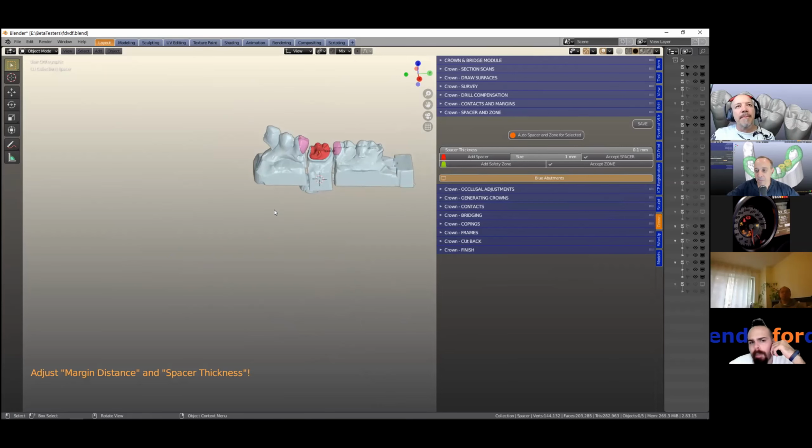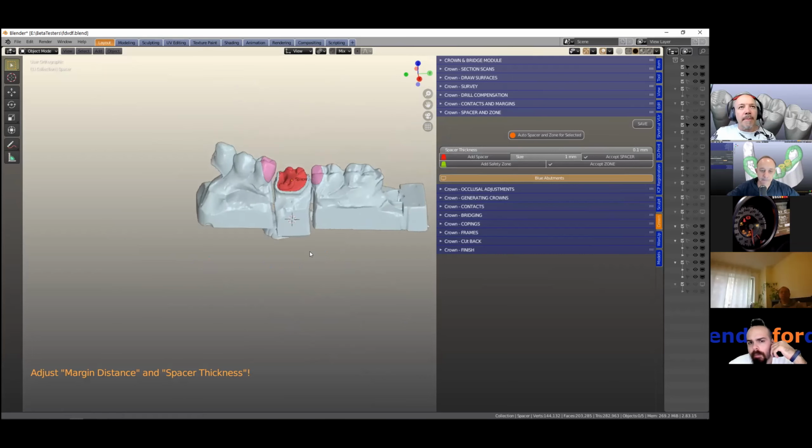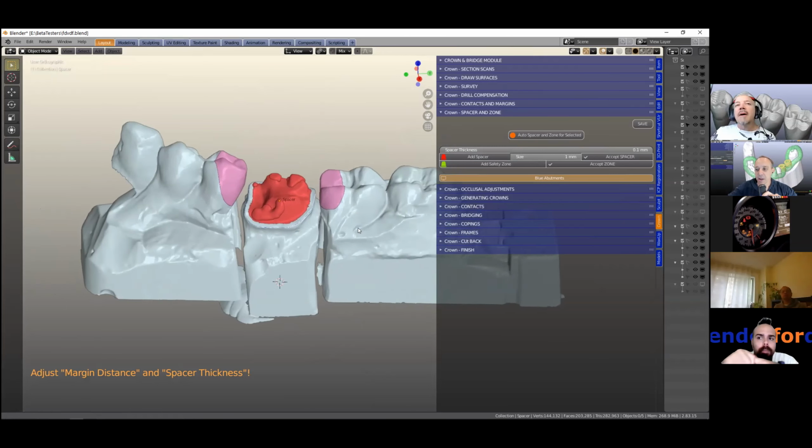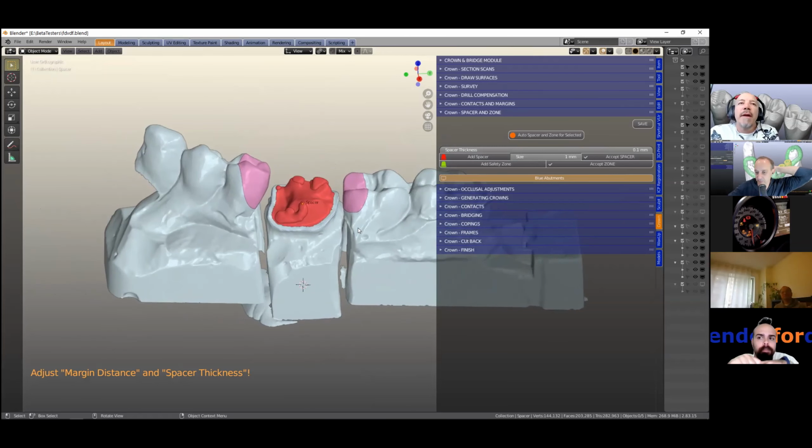The problem is only for crowns, because as I mentioned, on Exocad the gap is added all around on posts and on veneers. So there's a default gap set, Michael, yeah. Hexacan. Okay, I think it would be cool to have. Maybe you can show me on your thing.